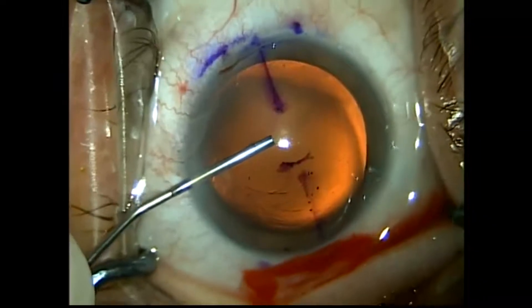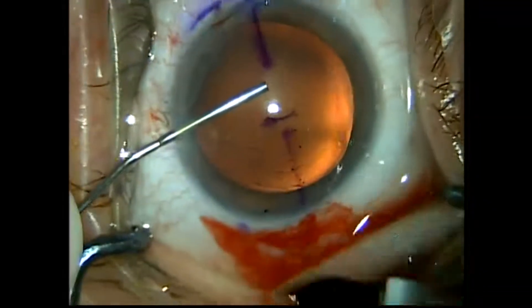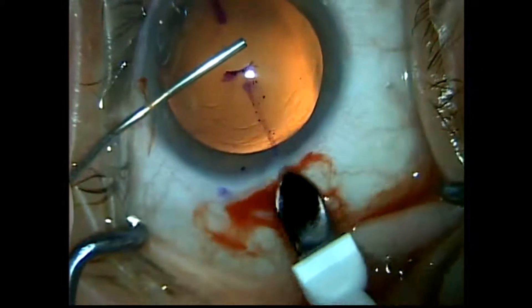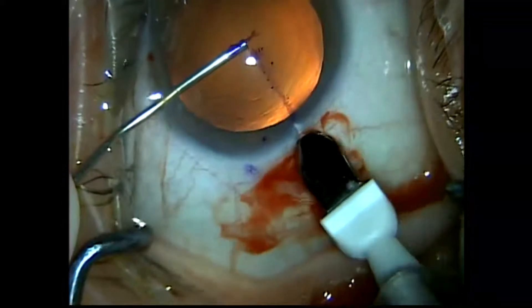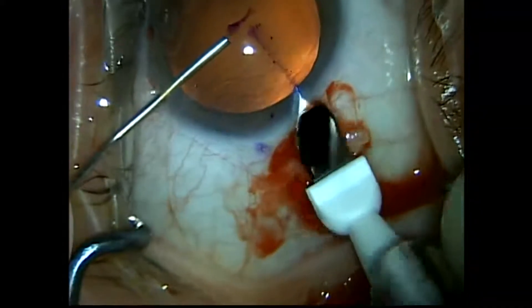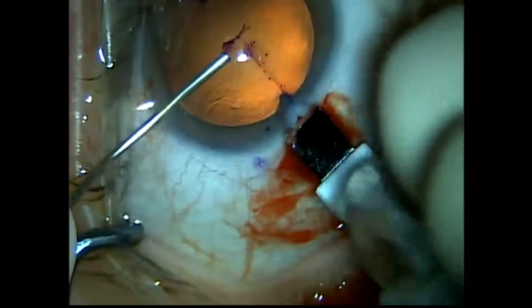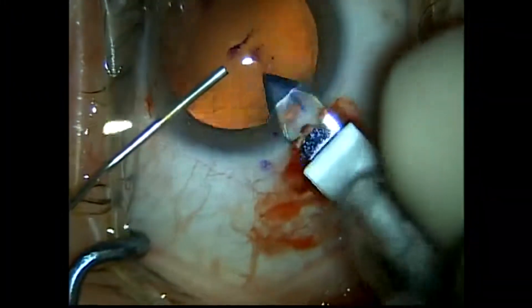I enter into the eye through the sclera with a 2.8-millimeter keratome blade. My expectation is that this 2.8-millimeter entry combined with my 4-millimeter limbal relaxing incision will reduce this patient's 1.25 diopters of astigmatism at axis 30, so she'll have an astigmatically neutral refraction at the end of the day.